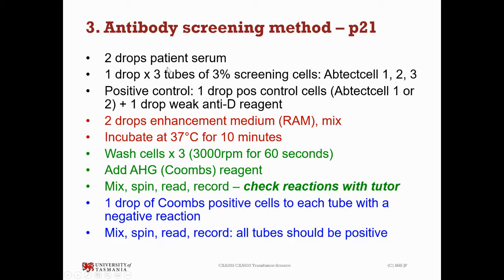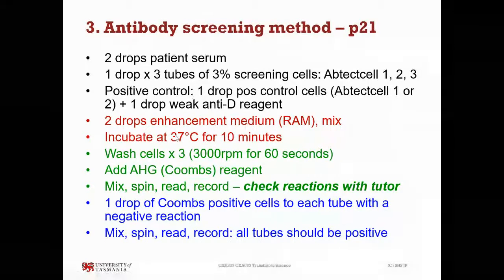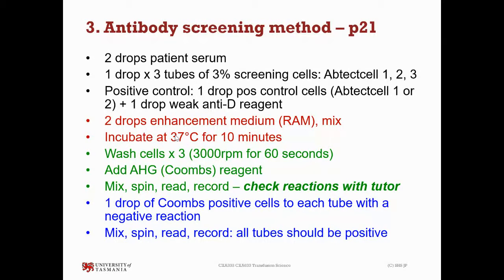So once we've added our patient's plasma and our reagent red cells, our screening cells or our panel cells, then we add our enhancement medium. So remember, this enhancement medium allows us to only incubate for 10 minutes because we're very busy people, aren't we? So after the incubation time, we need to wash our cells.